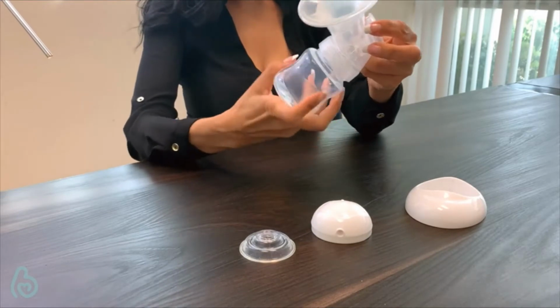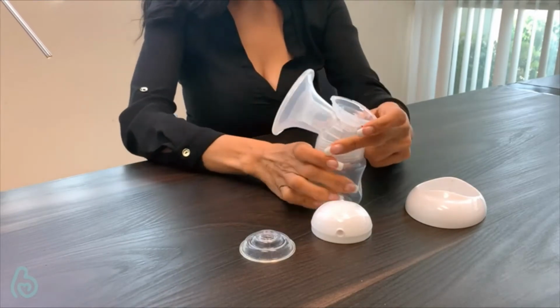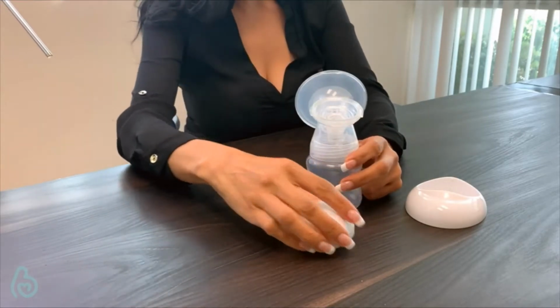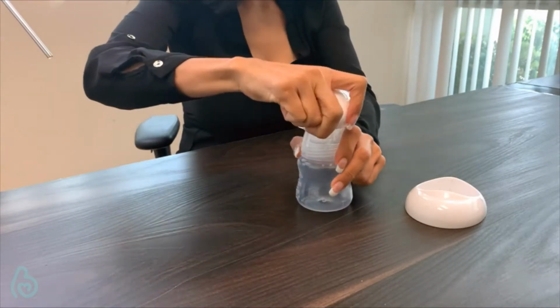Now, you want to screw the bottle to the breast shield. Insert the silicone diaphragm and screw cap on tightly.